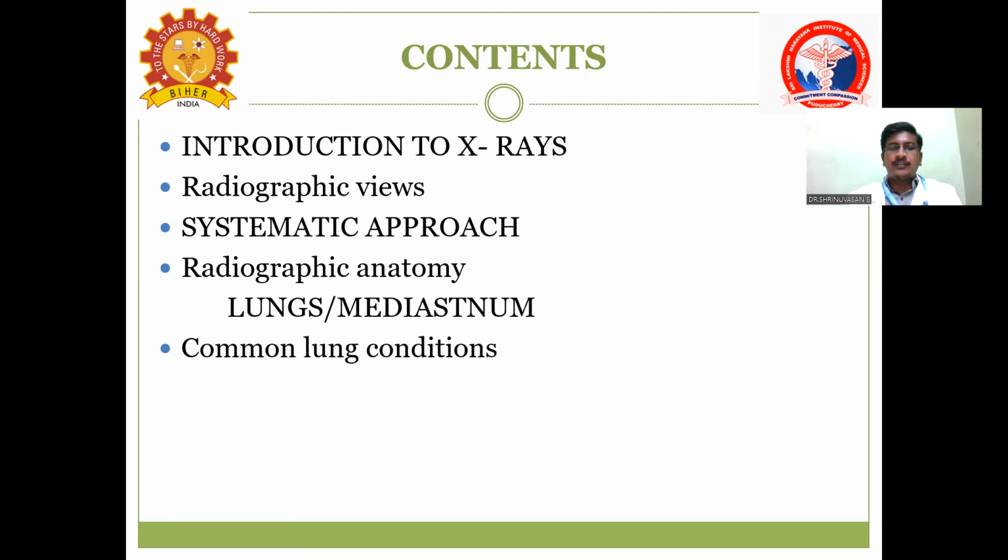Next we are going to see the radiographic anatomy: what the lung compartment is and what the mediastinal compartment is. We are going to see this in detail. Then common lung conditions, the conditions that we encounter day to day, in daycare, OP and ICU X-rays, and emergency. We'll discuss common lung conditions next.